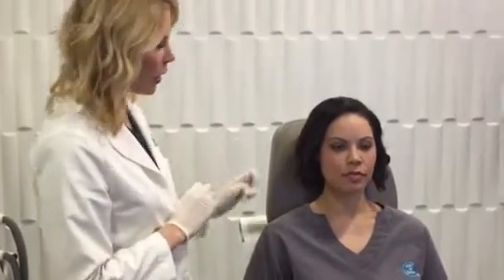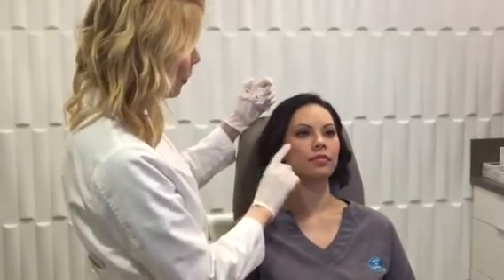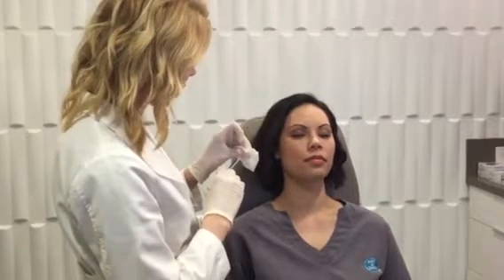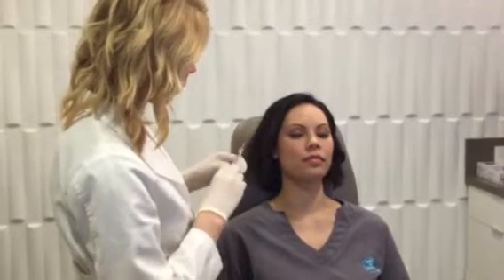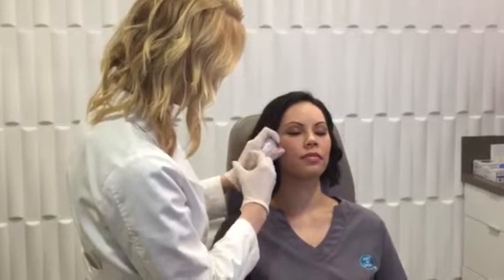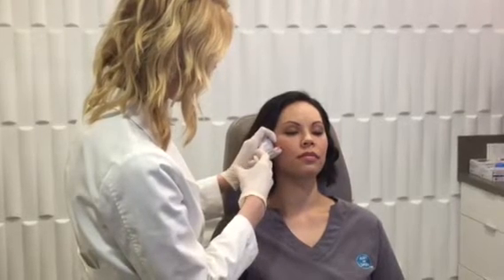So when we're using it to enhance the cheekbone area, I'm going to have you lean your head back. We use it right on top of periosteum, which is the bone. So I'm going to do a little poke on 3. Why don't you close your eyes for me? And we'll put a subtle amount just right here at sort of the apple of the cheek, what we call the apex of the cheekbone, or the zygoma is our technical term.